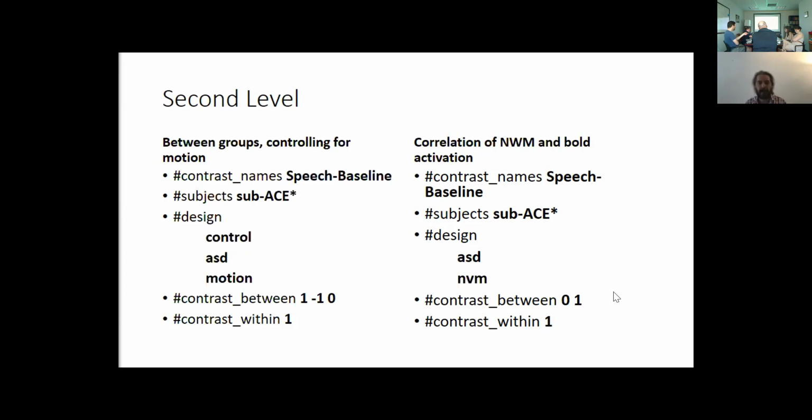So if age was added in as another covariate of non-interest, you'd want to center it if you were trying to get the correlation of the novel words per minute? I'm not sure if I understood correctly, but if you add age to this contrast, and you still look at the 0-1-0 contrast in this case, which would be like looking at the novel words per minute after correcting for the correlation with age, it still doesn't matter whether you center the NVM or the age covariates.